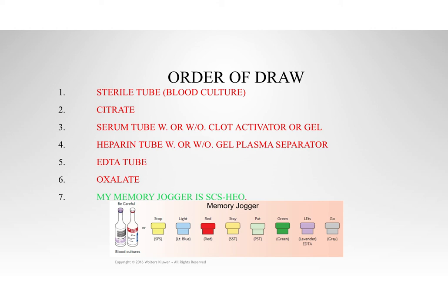SCSHEO. Sterile, citrate, serum, heparin, EDTA, oxalate. SCSHEO. That's my memory jogger. So I hope it helps you guys too.